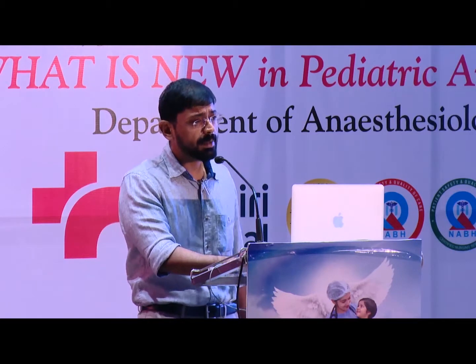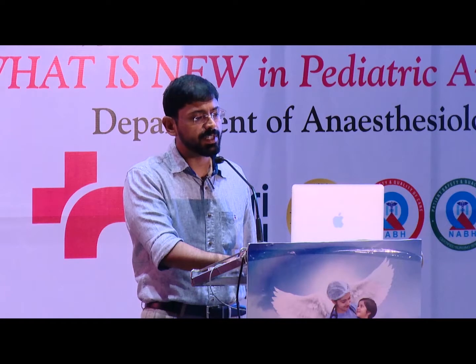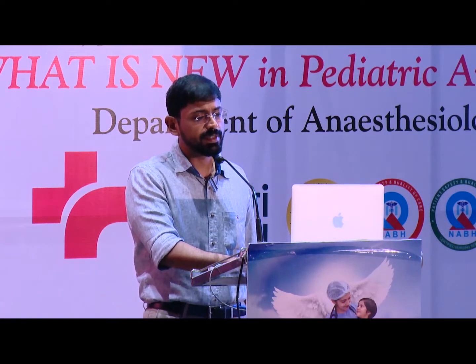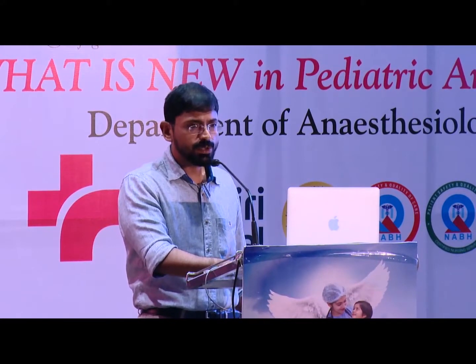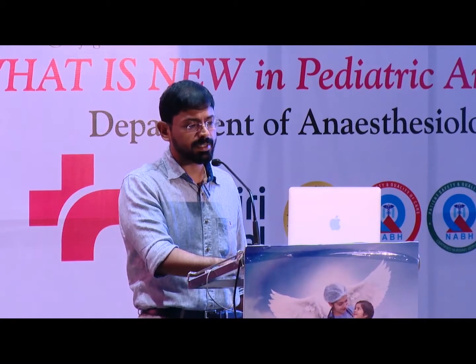What is too high a MAP for a newborn baby? It actually depends on the size of the baby and the severity of the lung disease. Generally, any MAP more than 16 is very high. What is too high a delta P for a baby? It also varies from baby to baby. Seldom do we need a delta P more than 30 in our practice.